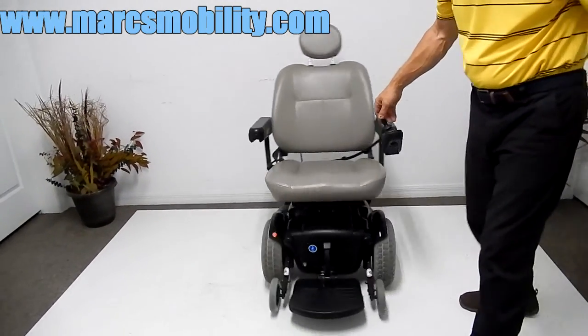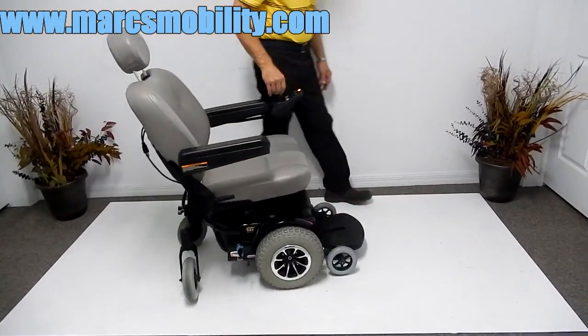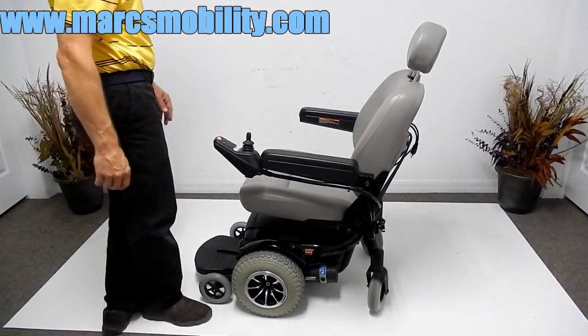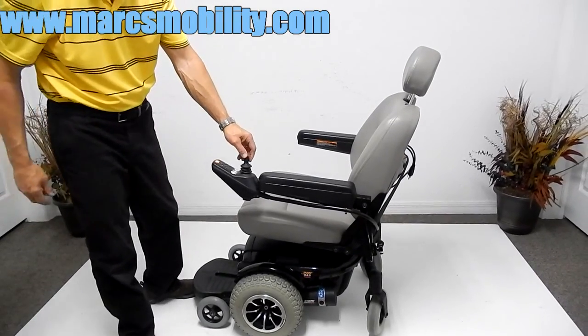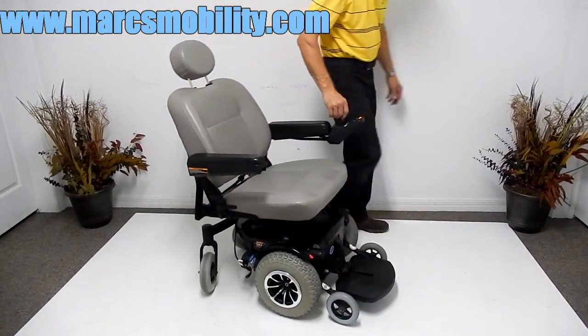If you want to know the turning radius, watch me turn it — this is pretty much what your turning radius is. If you have a three-foot ruler that's 36 inches and you can turn it in a circle on the ground, this is pretty much what this chair would do, because this chair is about 36 to 38 inches long.